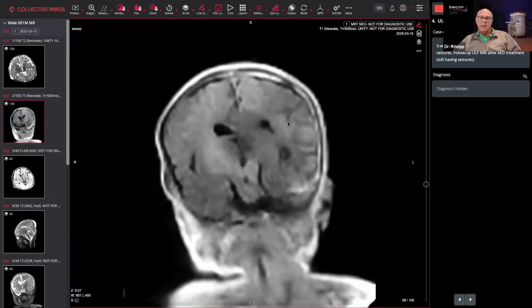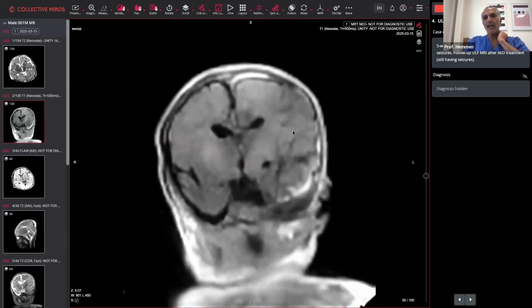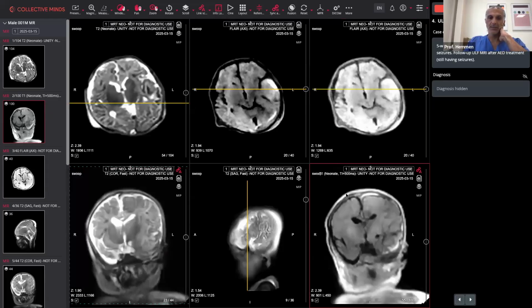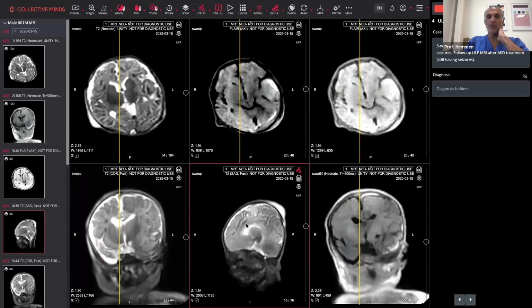Hemant, is there anything you'd like to add? No, so thank you very much. So for me, the question would be, from these images, if we think this is suspicious for trauma or following trauma, should I be concerned as a clinician of serious or severe edema and serious swelling? Is there something you can say about that?